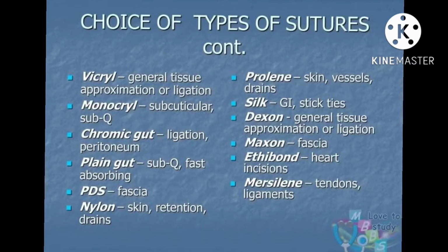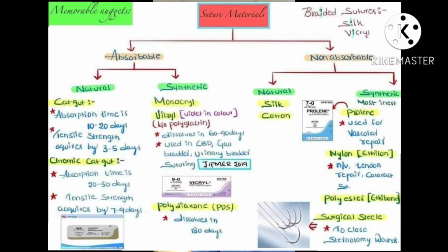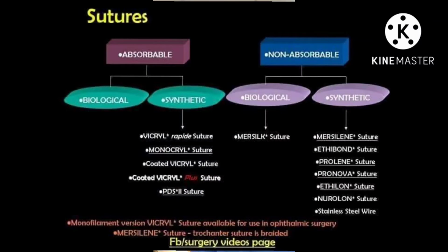can withstand before breaking. According now to the suture permanence, an absorbable suture is made either of natural material that undergoes enzymatic digestion or synthetic material that is hydrolyzed by water.